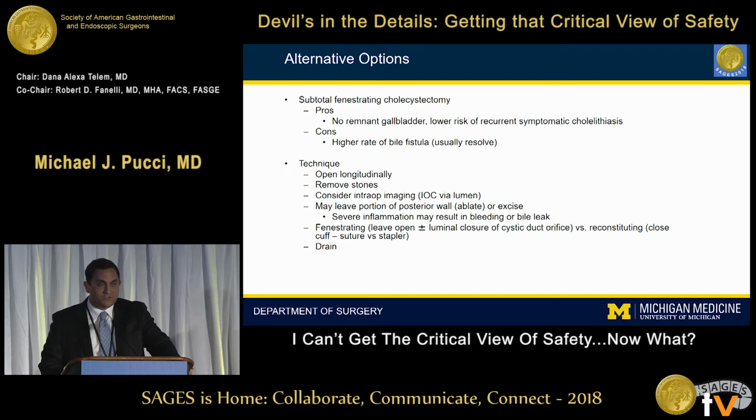Of course, consider intraoperative cholangiography if there's any concern. Again, you may or may not dissect the posterior wall of the gallbladder, and then either close or not close that lowest cuff of the gallbladder. A lot of surgeons will consider draining these difficult cases as well.